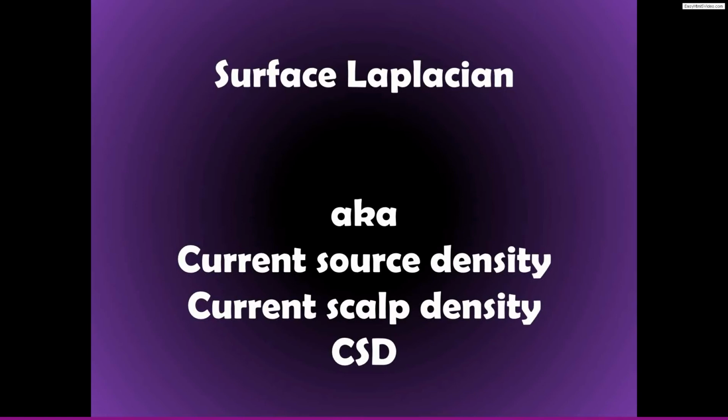These terms are all used or can be used more or less interchangeably. I have been guilty of using these terms interchangeably. After some thought, I settled on using the term surface Laplacian, so I recommend sticking to that term. But you will see these other terms in literature, and very often they are just different terms that refer to the same thing. So what is the surface Laplacian?